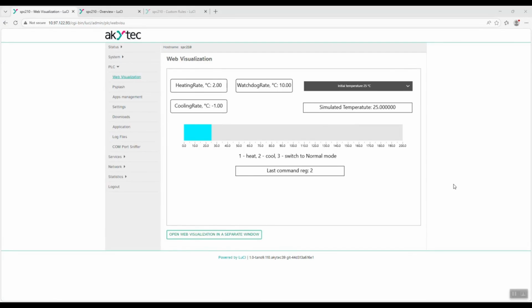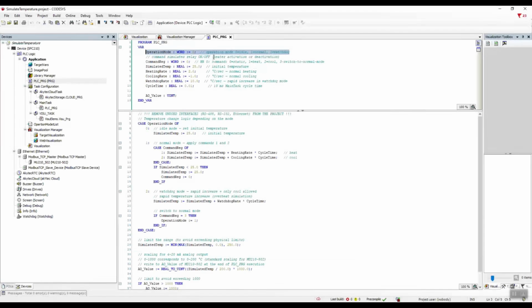Let's break down the emulator algorithm. First, let's look at its variables. Emulator operating mode. 0. Initial mode. Simulation of the initial temperature in the sterilizer. 1. Normal mode. Simulation of heating, increasing temperature, and cooling, decreasing temperature, according to the emulator's specified settings.